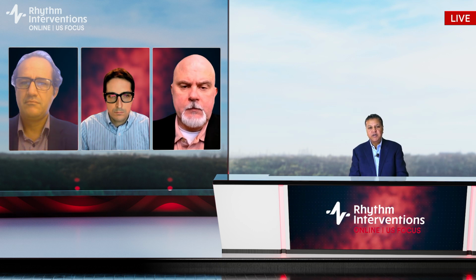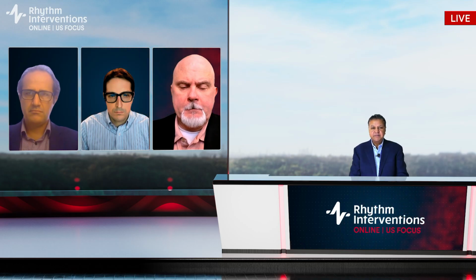Rodney, thank you very much for that case. The way of doing it, yeah. So can you just comment on a few things? Number one is, in this new era of PFA, how are you choosing between achieving the desired ablation using this technology, versus PFA? And the other is, I believe your group early on had reported some issues with perforation, which allowed you to understand better how to optimize delivery of energy with this catheter. What can you teach the audience about that?